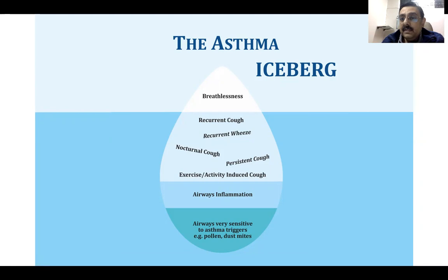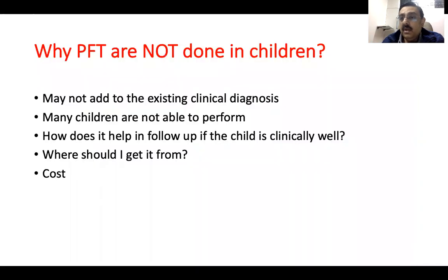With this background, we all know that although we have been talking about lung functions in detail in many conferences, PFTs are hardly done in clinical practice. That is the truth. But why? There are practical things associated. Most people would say, how does it add to your clinical diagnosis?